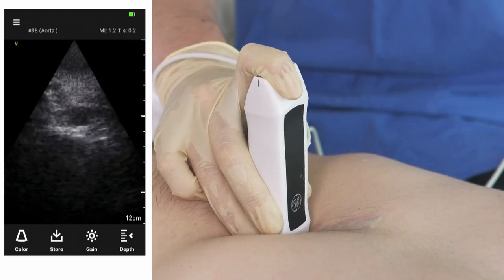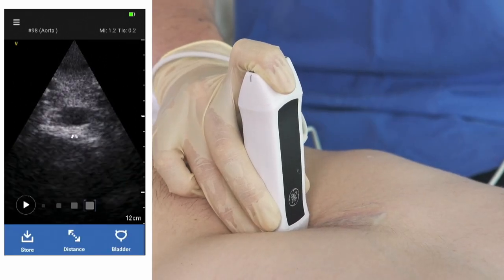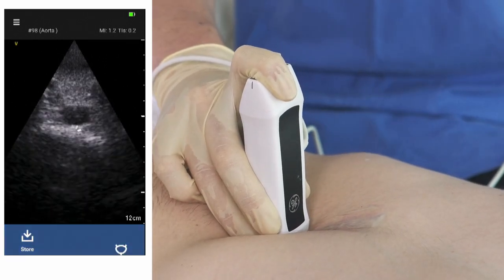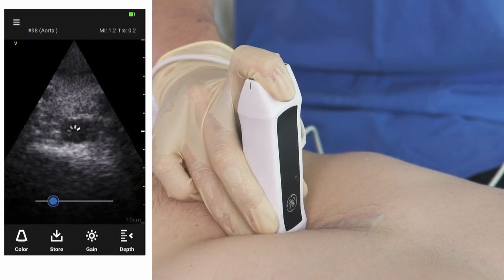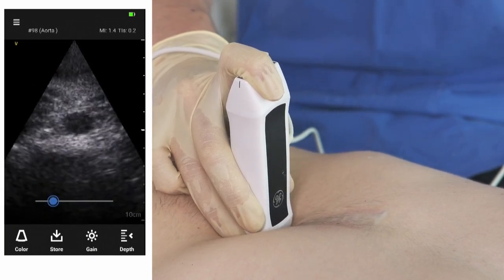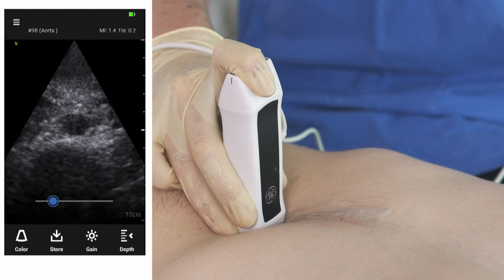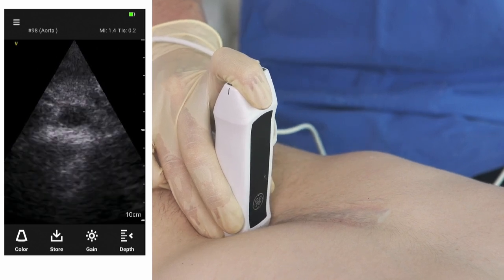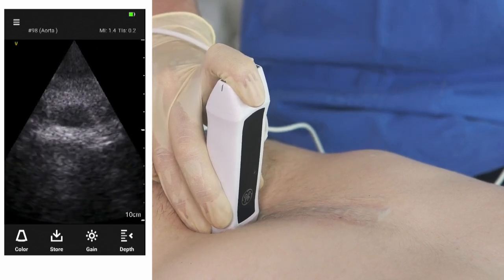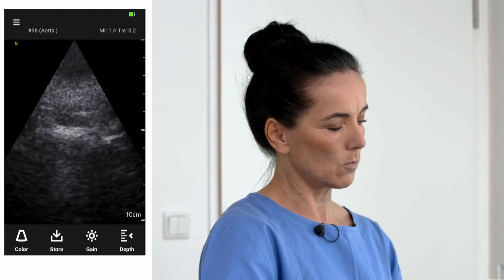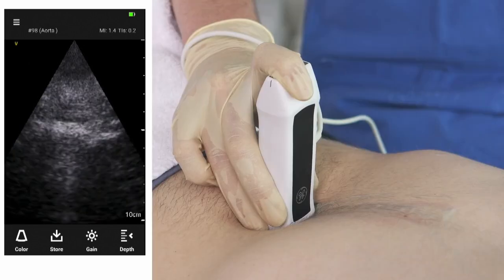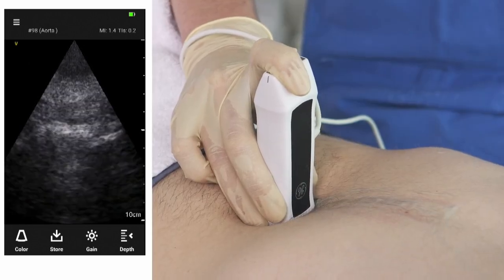Continuing more caudally, slowly reducing the depth, you reach the navel area and the bifurcation area. Focusing on the screen here, there's a little bit of bowel gas in the way, and you may want to press a little bit with your transducer to displace it.